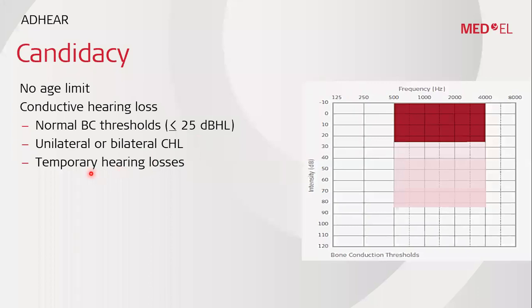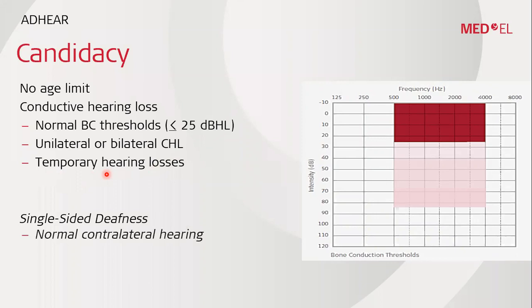For sure, it's an amazing solution for temporary hearing loss patients. So maybe after a middle ear surgery or something like this, it can be a solution for temporary hearing loss patients. And also, it's a solution for the single-sided deaf patients. And for sure, the contralateral ear should be completely normal, and it will overcome the head shadow effect.